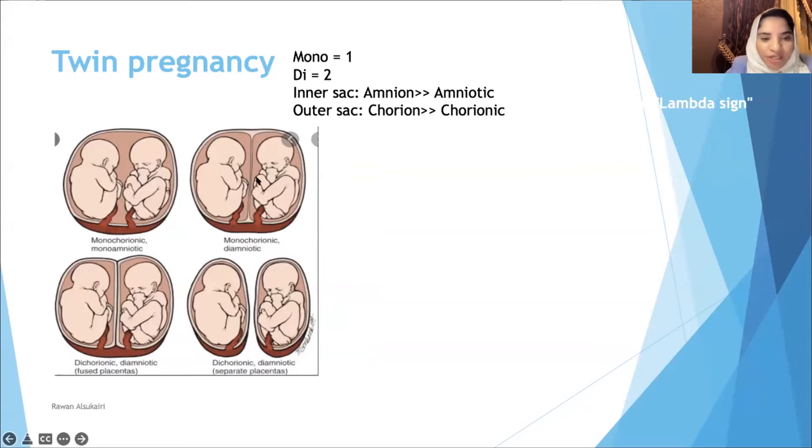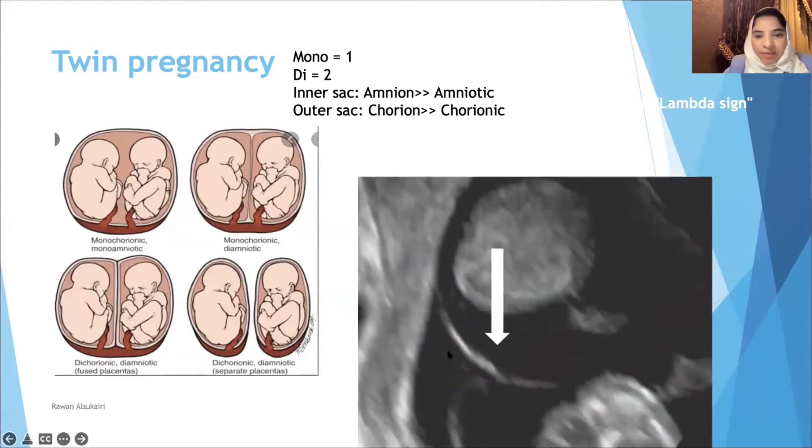On ultrasound, the monochorionic diamniotic twins will have the T-sign — it looks like the letter T. Whereas the di-di has a really thick membrane in the middle, called the lambda sign. The T-sign is really thin, so it will be diamniotic.